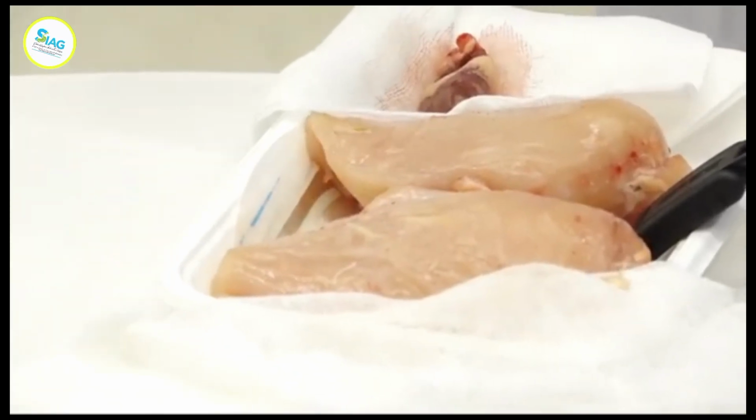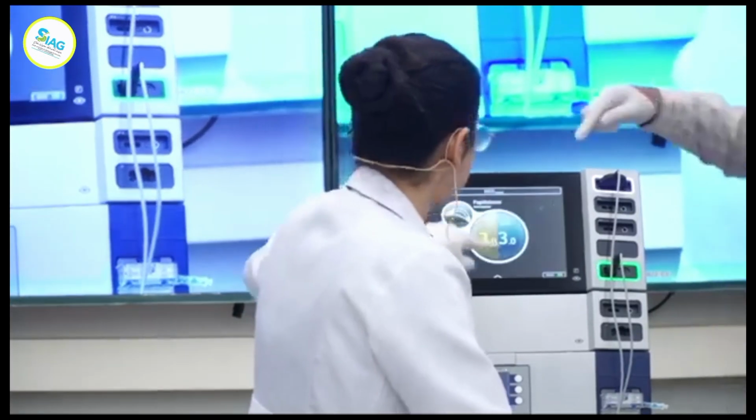If I go for pure cut, is that autocut for RB? Yes.